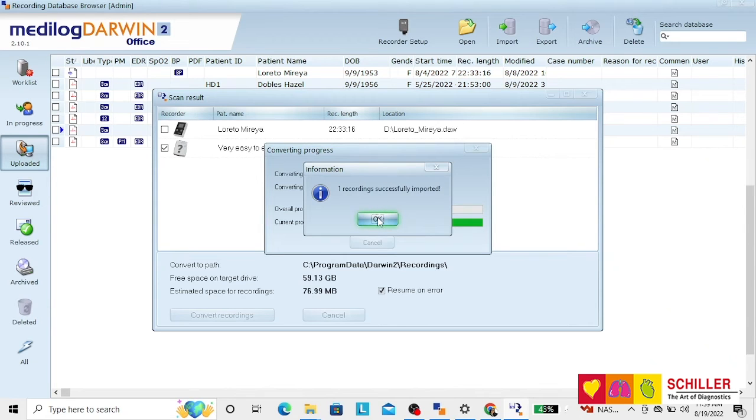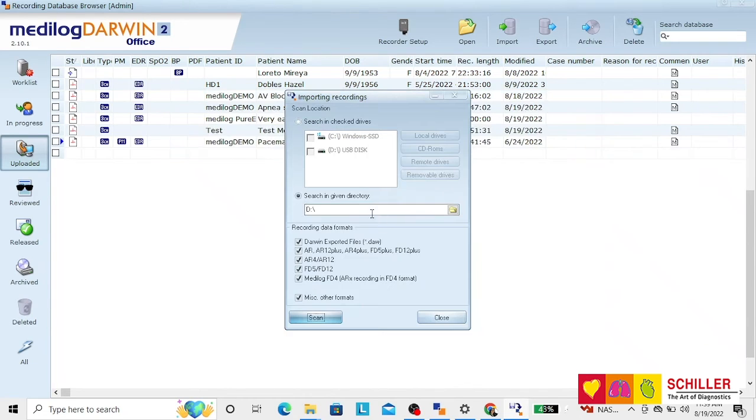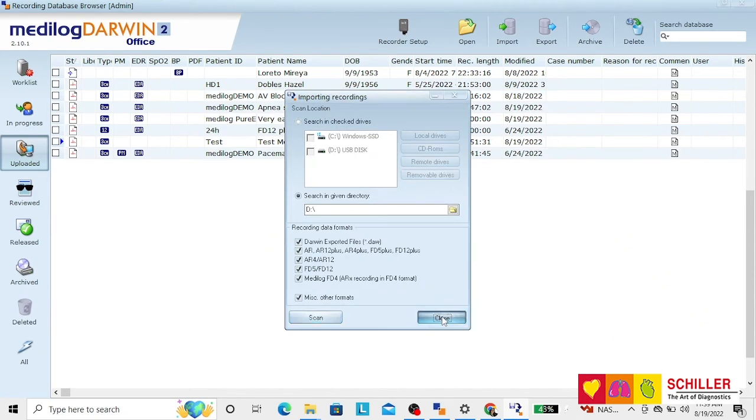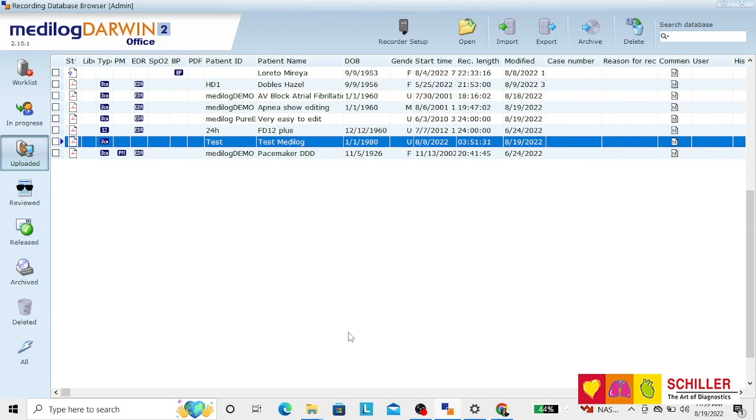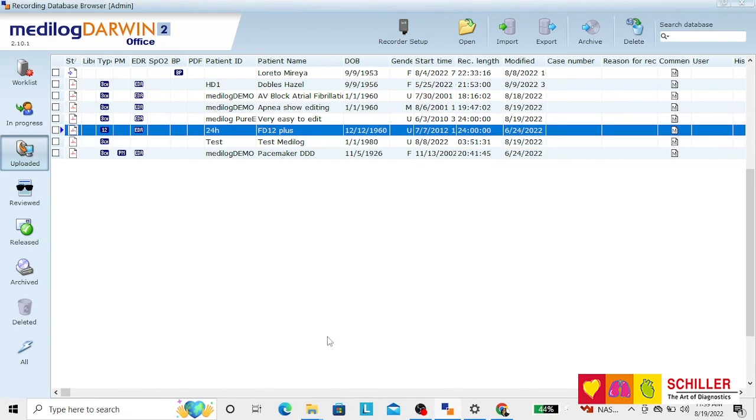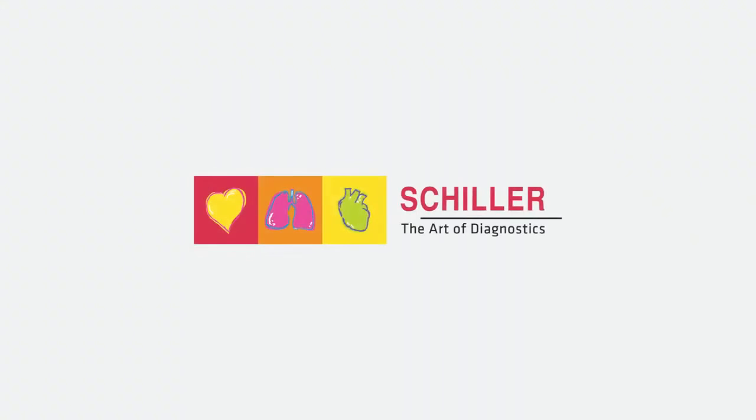Once the recording has been imported, click OK, close, and here you have the recording that you have just imported. The Observer will restart the next time that you restart your computer.